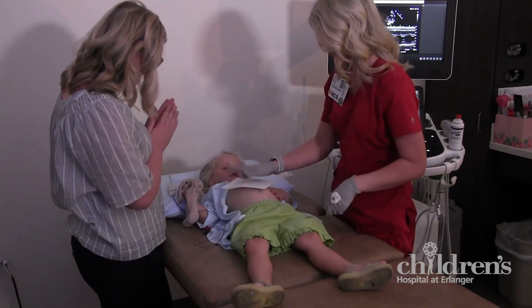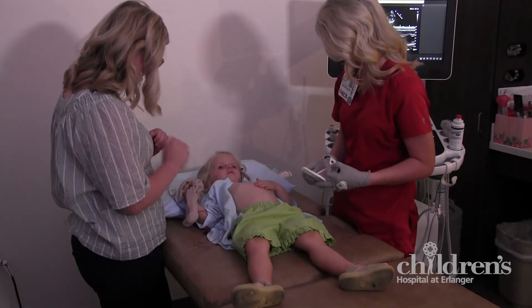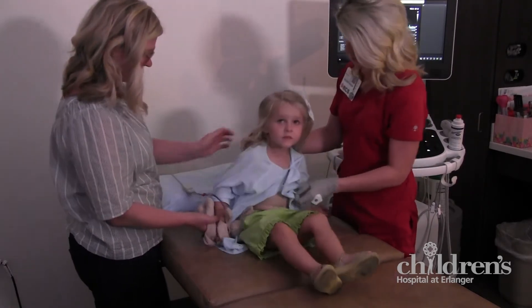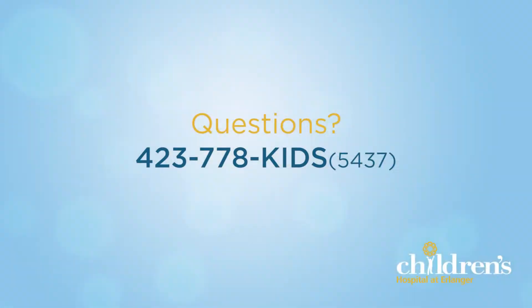And that's it! Time to wipe off that gooey gel. Immediately following your echo, you will meet with your heart doctor for results. Thanks for joining us for this Children's at Erlanger video. If you have any questions about your pediatric echo, please call the Children's Echo Lab at 423-778-KIDS. Thank you!